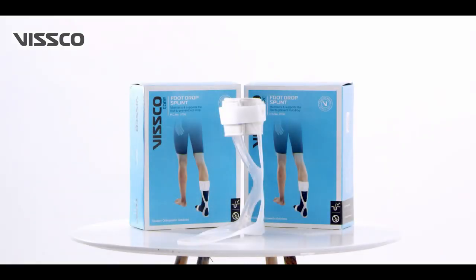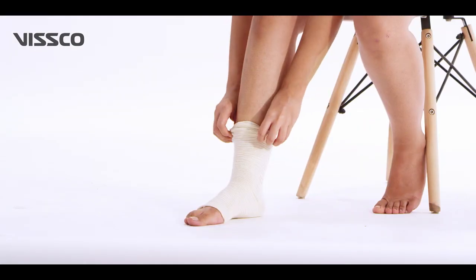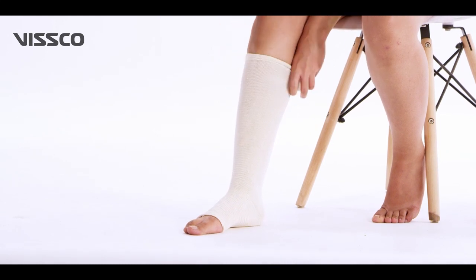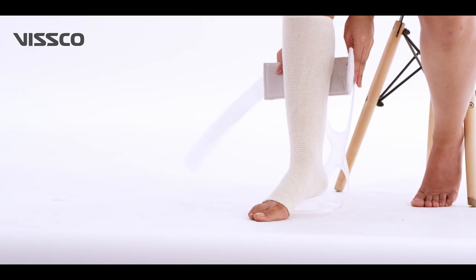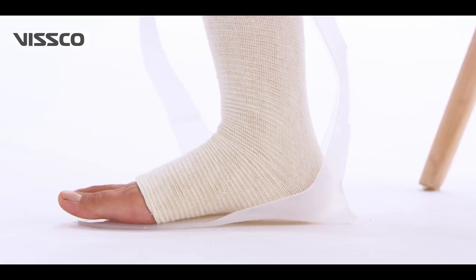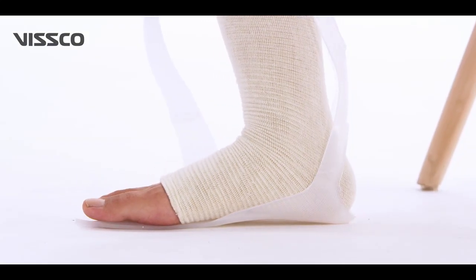Take out the foot drop splint from the box. Ask the patient to sit on a chair. Apply the cotton stockinette on the affected foot from toe till the calf. Place the affected foot in an upright position on the footplate. Ensure the heel is positioned and sitting properly in the groove.